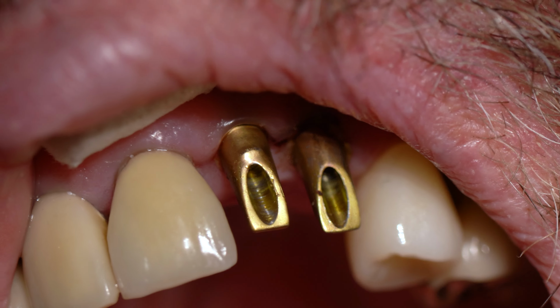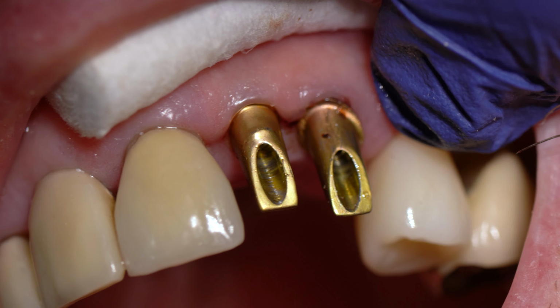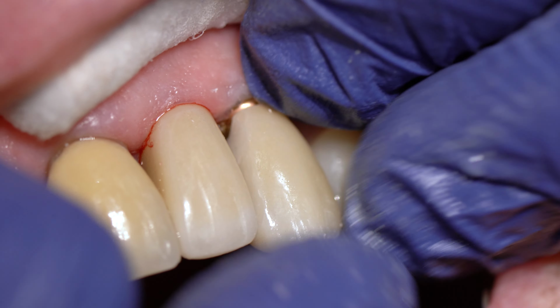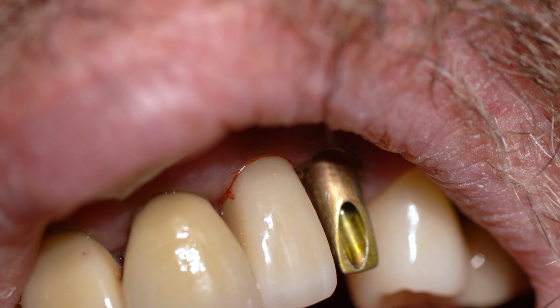So now I'm trying to see if there's any way that I can rotate this abutment clockwise or counterclockwise to see if I can get this crown to seat in. It's kind of like a last-ditch effort to see if it's going to seat all the way. So see, I'm just moving it around. You can rotate it just a little bit clockwise or counterclockwise and see if that allows the crown to seat, or if you can adjust a little bit to seat it. So it's just not seating down the way that I want. Here I adjusted the crap out of it just to get it to seat, because I already determined that this one is a do-over. The impression was wrong, but I don't want to send the patient home with no tooth.